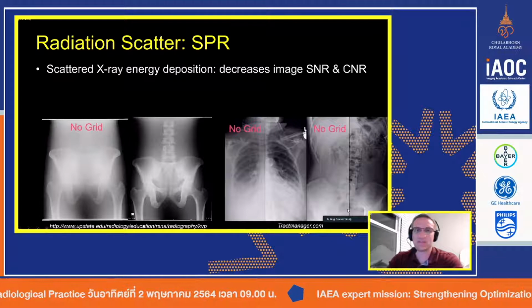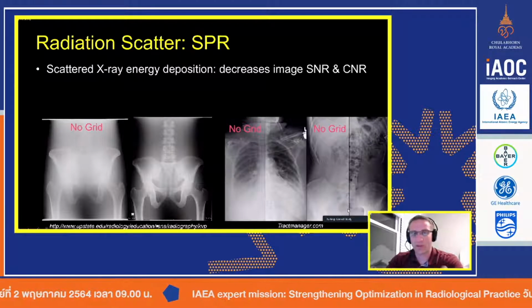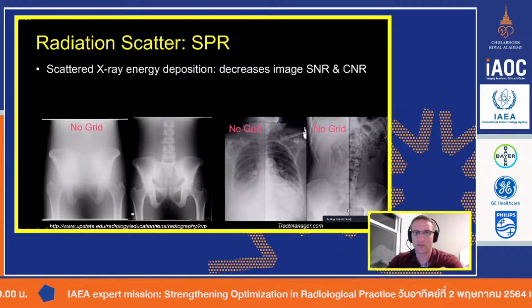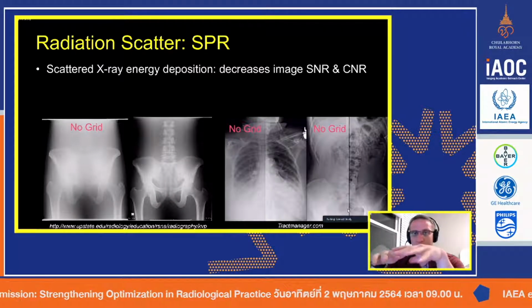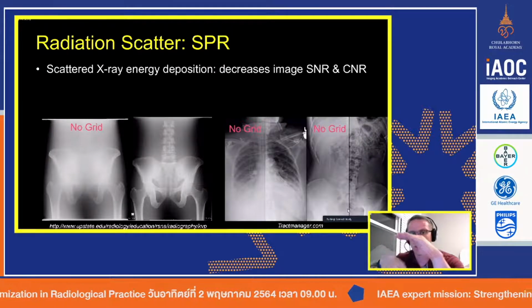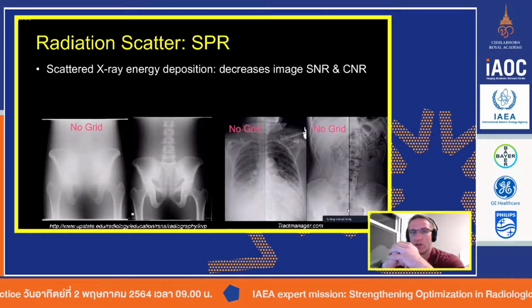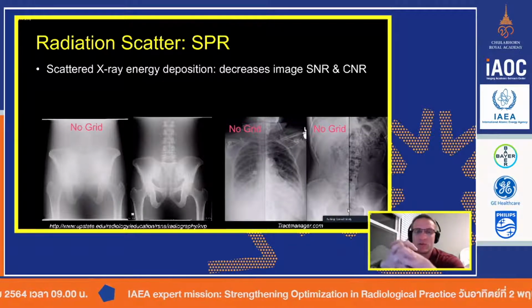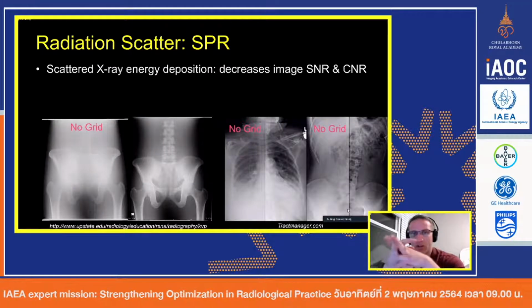All right, so we have to deal with scatter, right? Let's talk about scatter. We don't think about it as much because when we image in normal radiography in our fixed rooms, we bring our patient, we lay them on the table, and there's always going to be a grid between the table or the patient and the detector. Same with the wall bucky. When you're doing your portables, you usually have a snap-on or a cover grid. So we just don't think about grids as much because we use them all the time, every day.